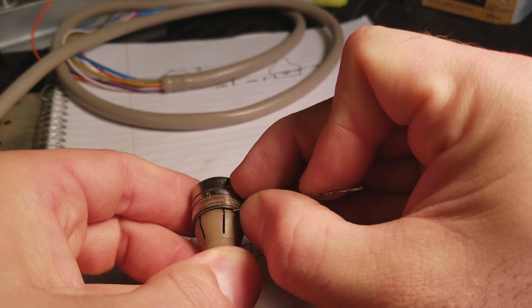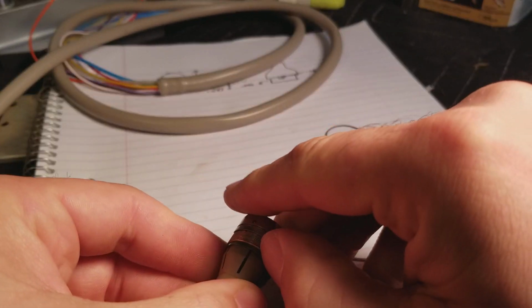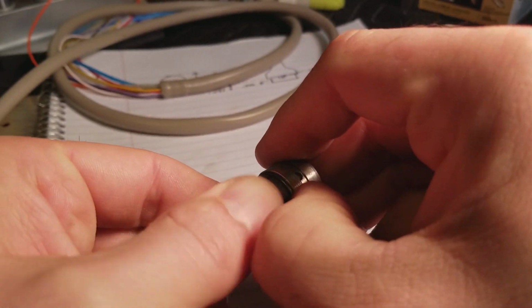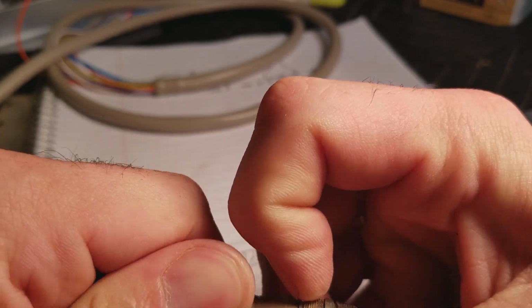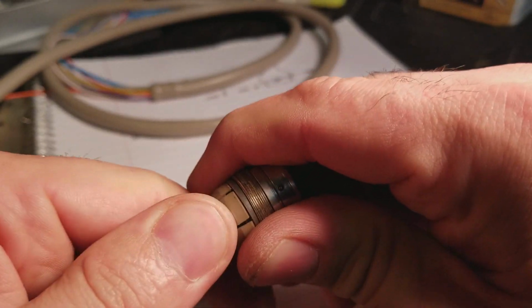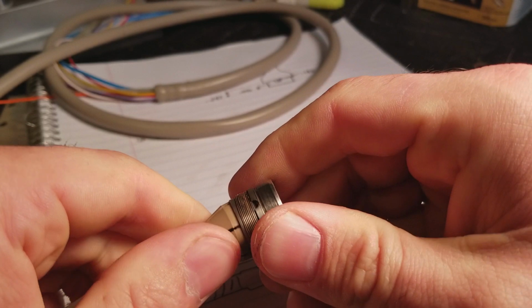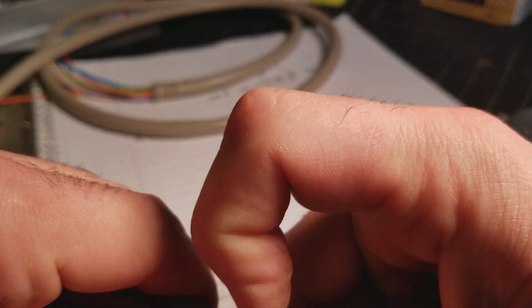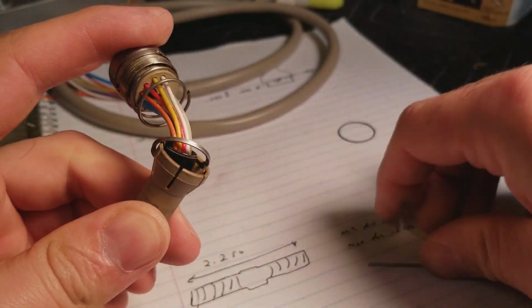See, I lifted it up, then kind of spring it free, and it should just kind of let go on one of these fingers. So there it goes, starting to go. You could probably make a little tool to help you with this as well. There it goes. So it's separating right now. So you can see I've gotten the ring up. Now I just got this one last finger to disengage, which, there it goes. Perfect. So you can now see the inside of this, what it looks like.